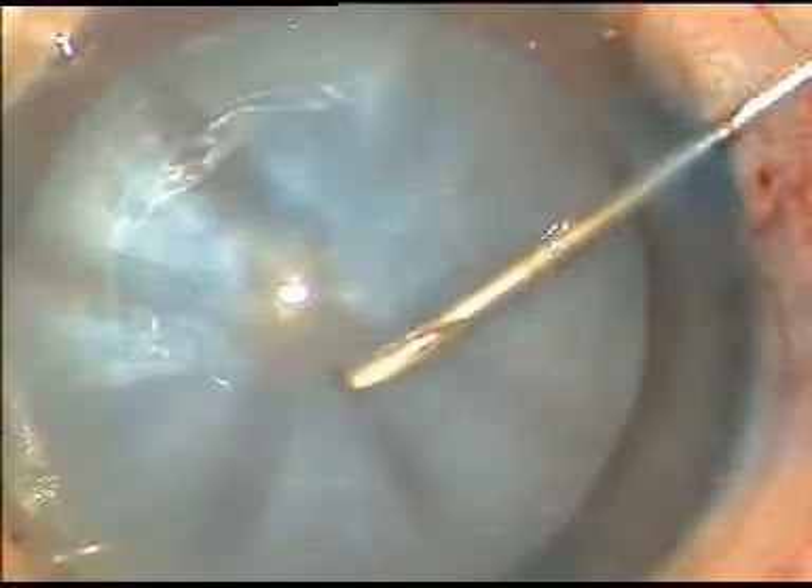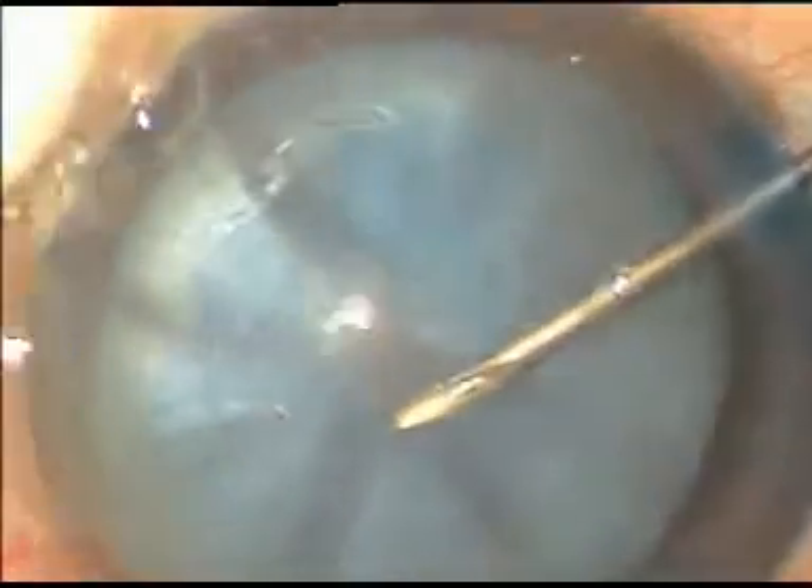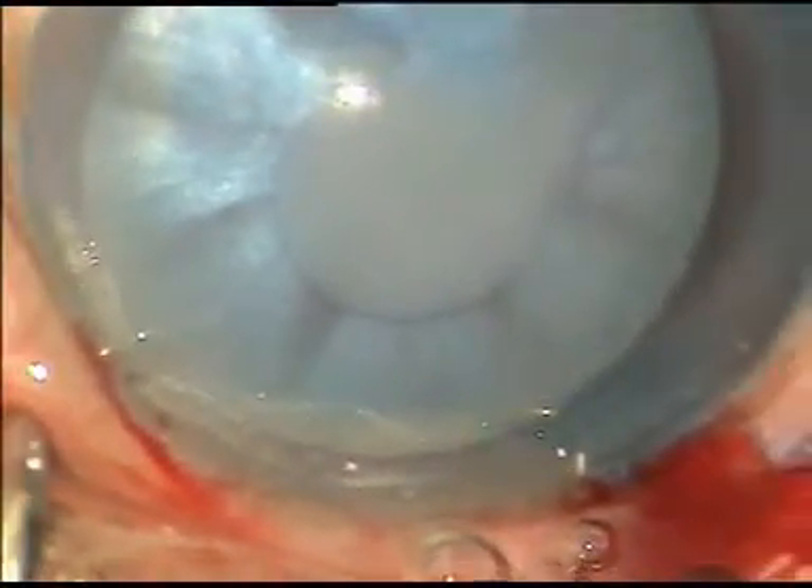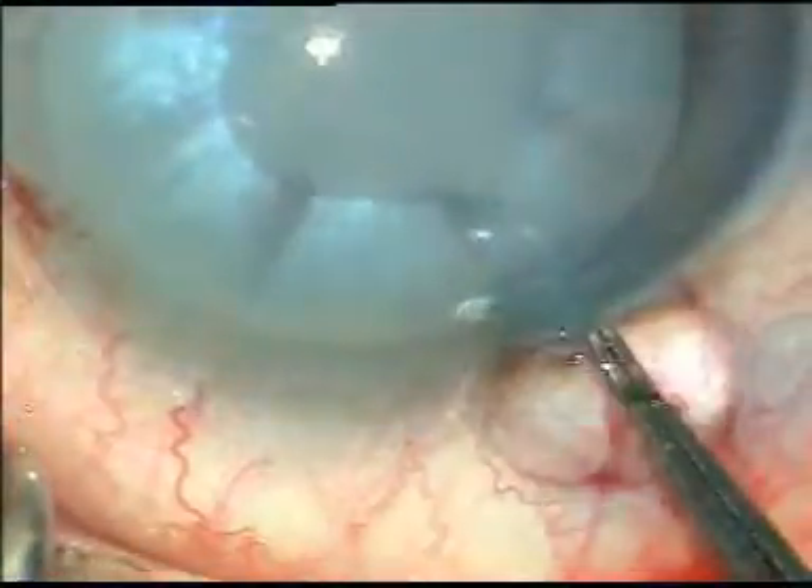Dear friends, this is my technique of doing capsulorhexis in a case of intumescent cataracts. The capsule has been stained with trypan blue dye, and the anterior lens capsule has been punctured at the center with a 26-gauge disposable bent cystotome.